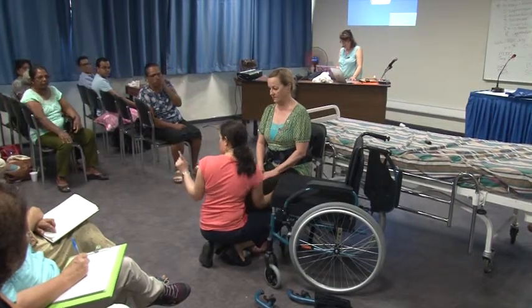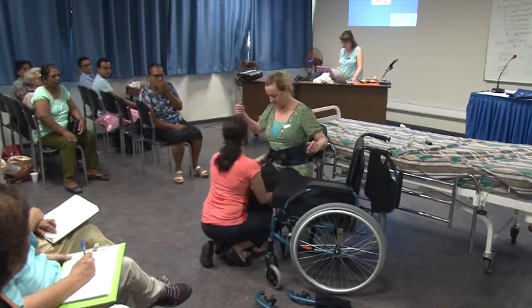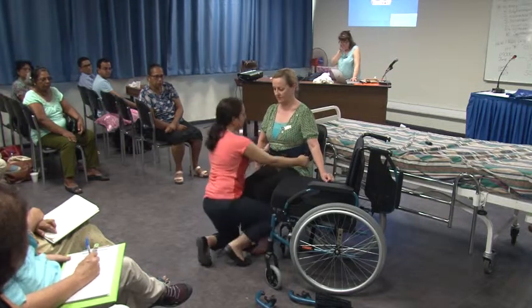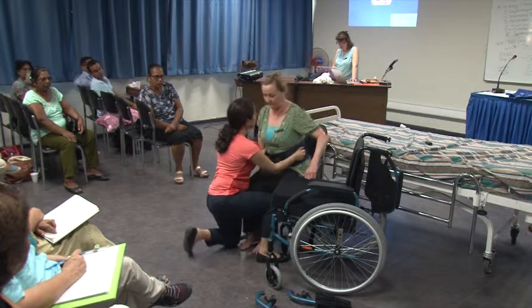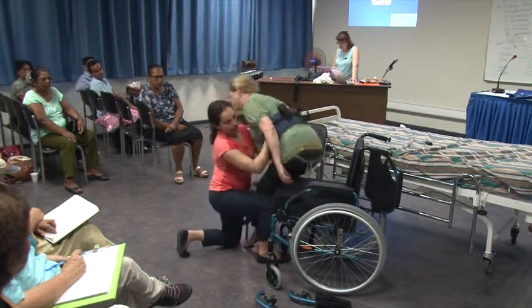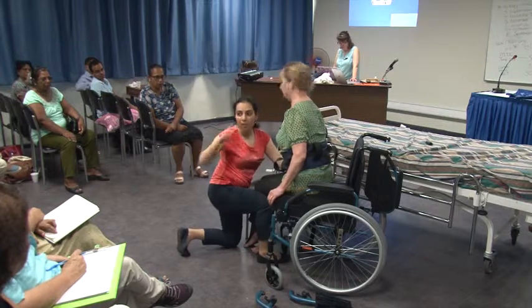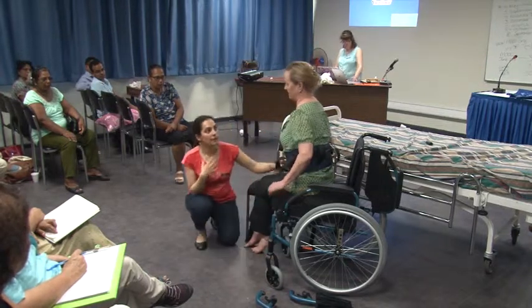This can be done by 2 people as well. So you've got, again, handles here and handles here for 2 people to maneuver. Okay, so I'm going to ask her to lean forward, lift and go. That's what I did, right? Just guiding the movement, I'm not lifting because we don't advocate lifting.